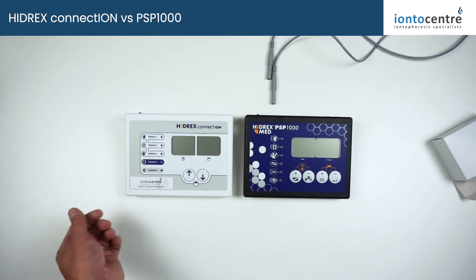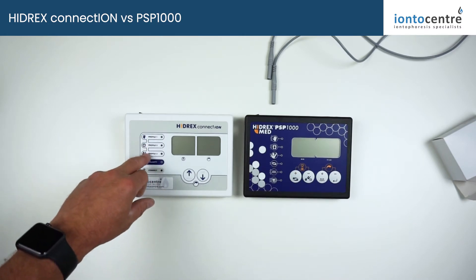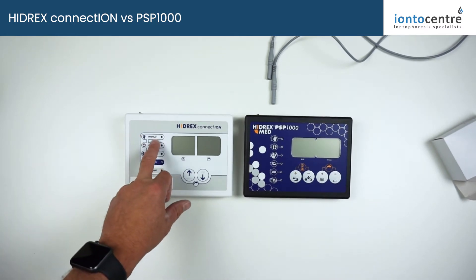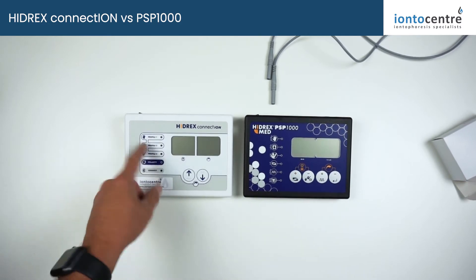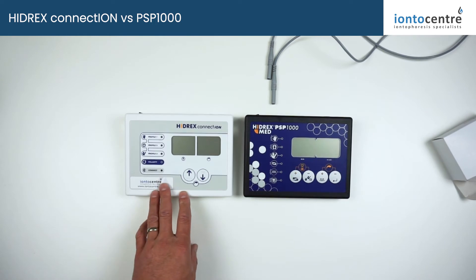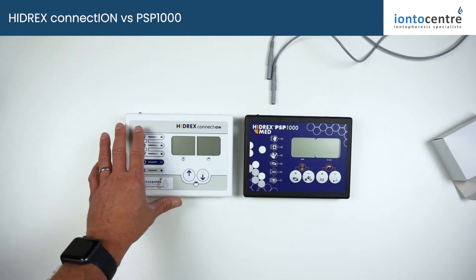15 minutes is the recommended treatment time for these machines. You've got three profile memory store points so you can store your settings for each different treatment area — so it's hands, feet, and underarms, or person one, person two, person three if you're sharing it within a family. They're not dedicated settings for the hands, feet, and underarms; they are literally memory storage points, same as what you had on the PSP1000.